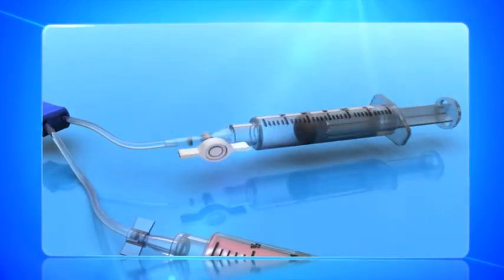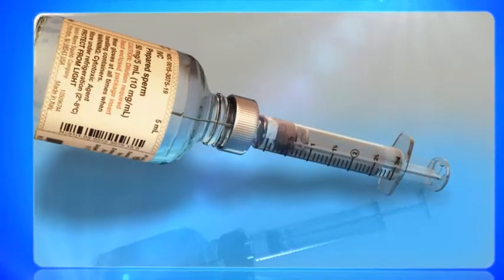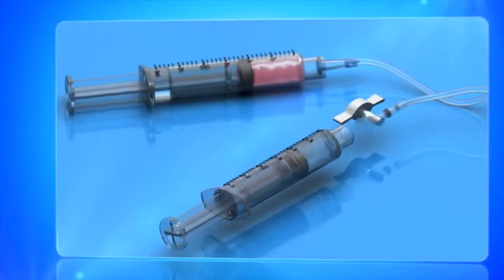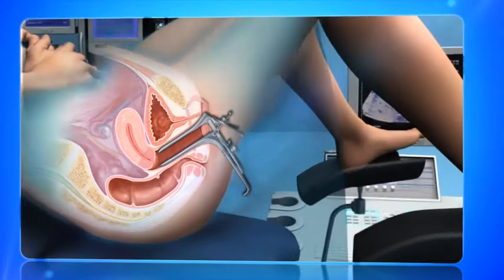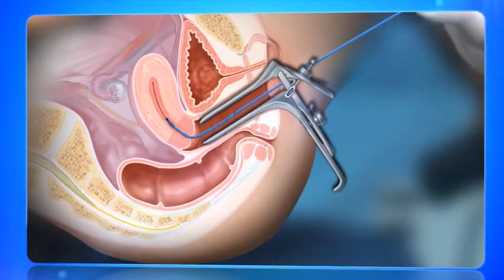Disconnect the balloon inflation syringe from the balloon inflation line of the catheter. Fill the syringe with no more than 1 milliliter of sterile saline solution. Reconnect the balloon inflation syringe with the stopcock open. Insert the catheter into the uterus, using the depth marks as a guide.